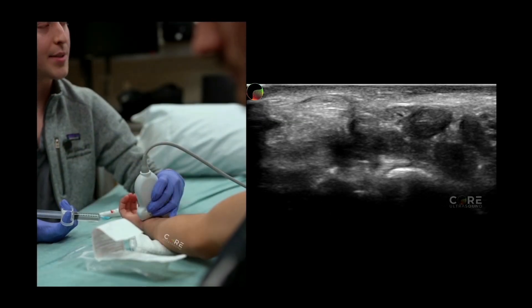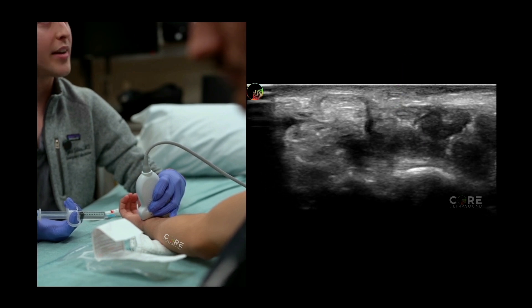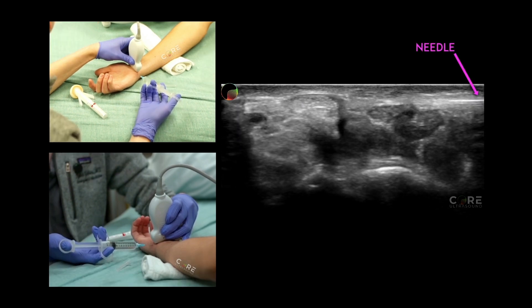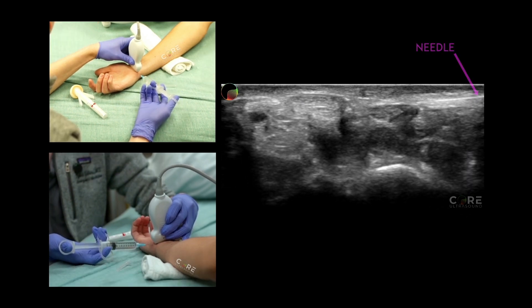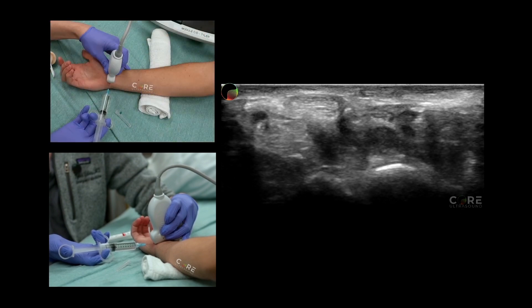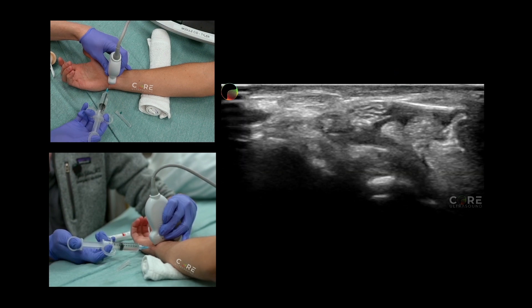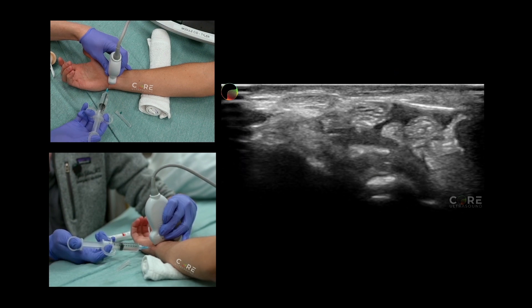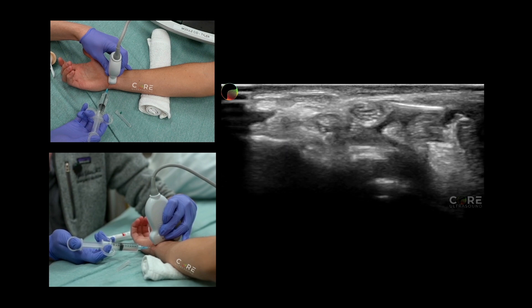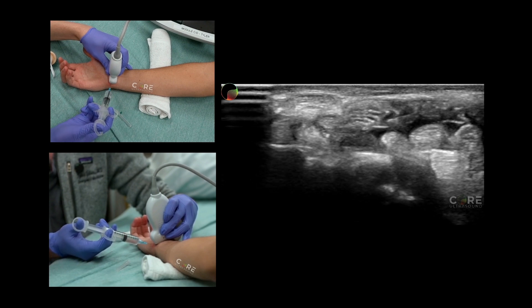We're going to be doing this from the ulnar aspect. This is going to be an in-plane approach right at the end of the wrist, right at the carpal tunnel inlet. We're going to go in with our needle and then go just above our nerve and inject about five cc's of normal saline solution. Then we're going to instill another five cc's just deep to the nerve.